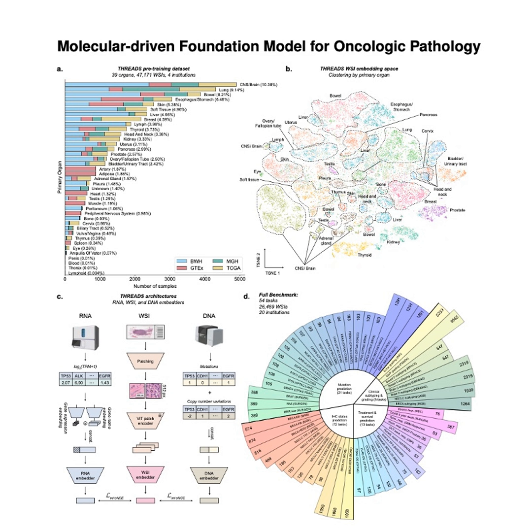Sure. Imagine you've got two big piles of data. Pile A has all your WSI images, and Pile B has all the matching DNA and RNA profiles for those same tissues.